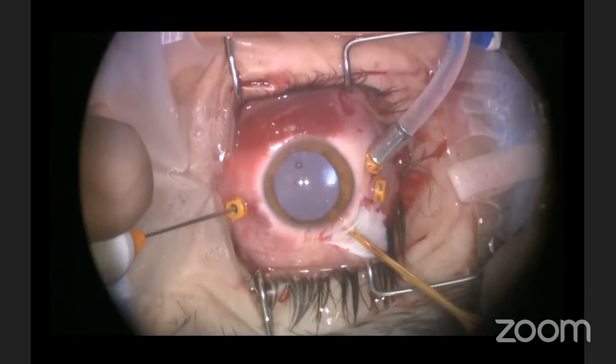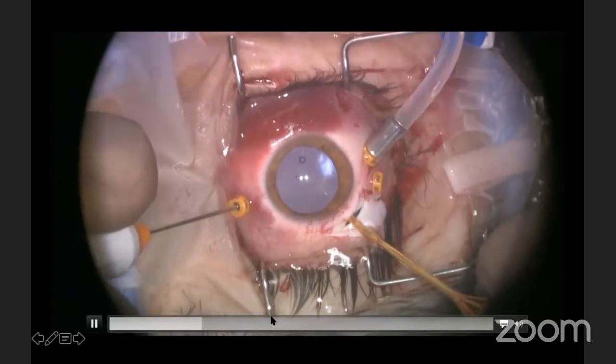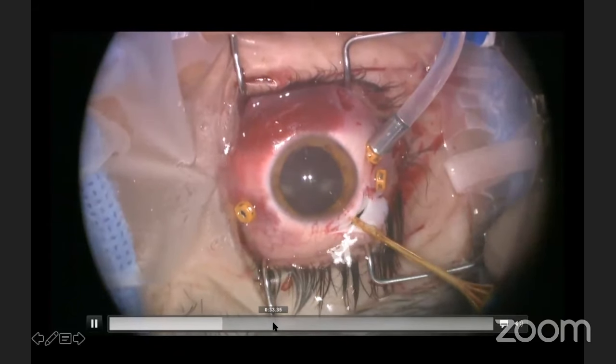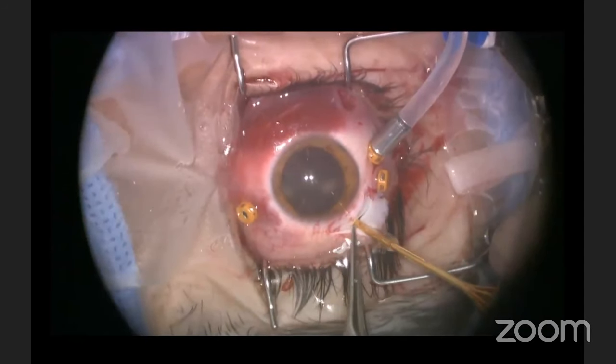So this is a simple foreign body removal after releasing it from the vitreous attachment and removing the surrounding encapsulation. We remove the foreign body through a sclerotomy, after shaving the vitreous at the sclerotomy site.